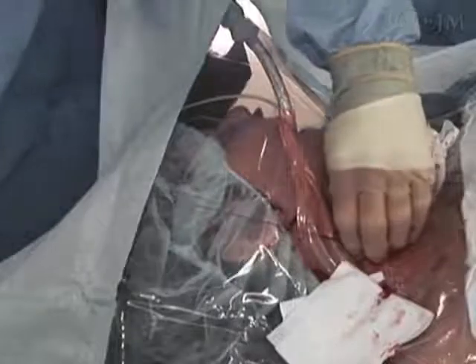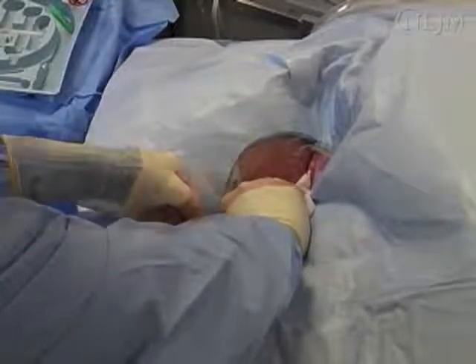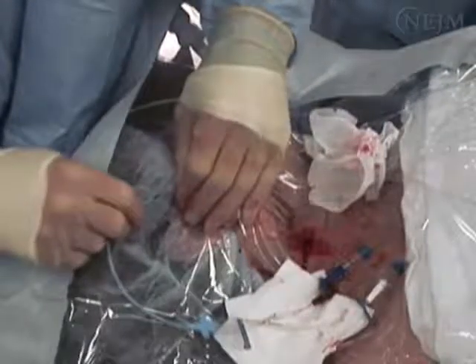Remove the dilator, anticipating increased bleeding. Maintain a grasp on the wire. A 4x4 gauze pad can be applied to the insertion site to minimize blood loss. Once again, only the wire remains in place.